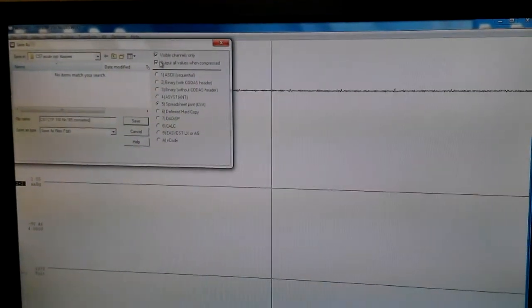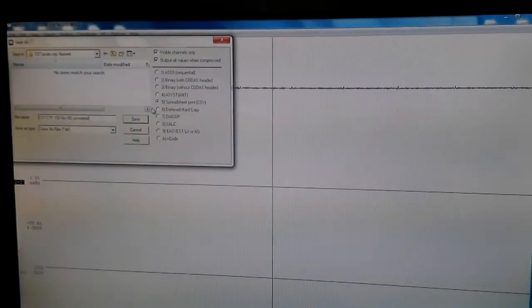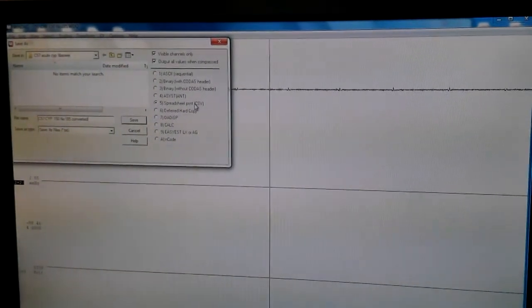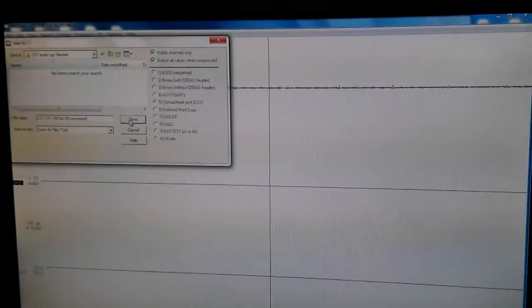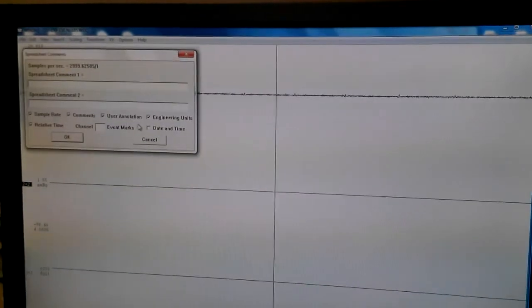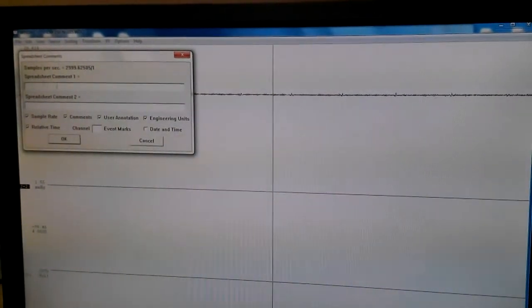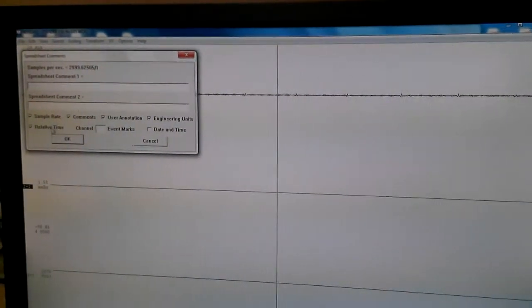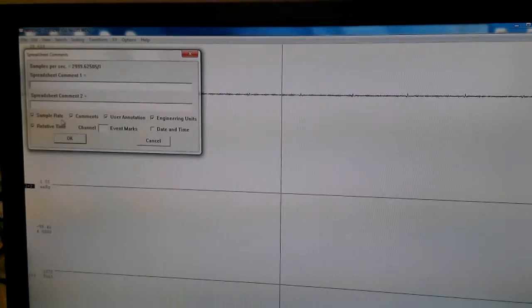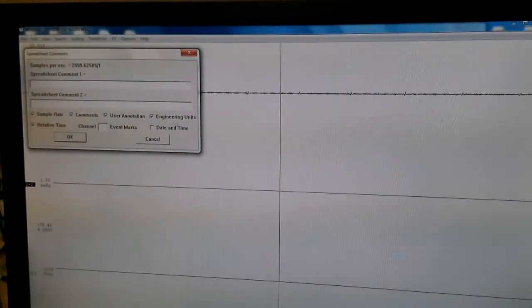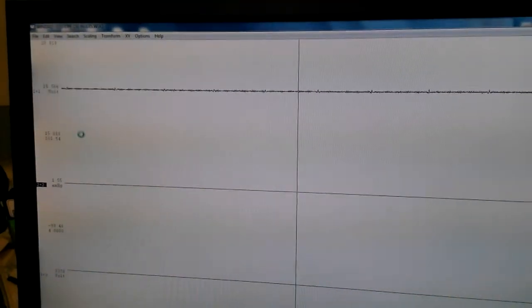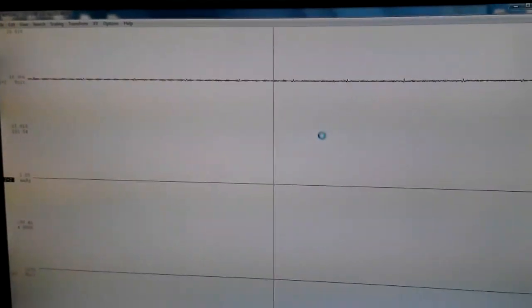And then you make sure that you have these clicked on and this one, spreadsheet print. And then you say save. You don't pretty much do anything as long as these are by default already clicked. You just say OK.